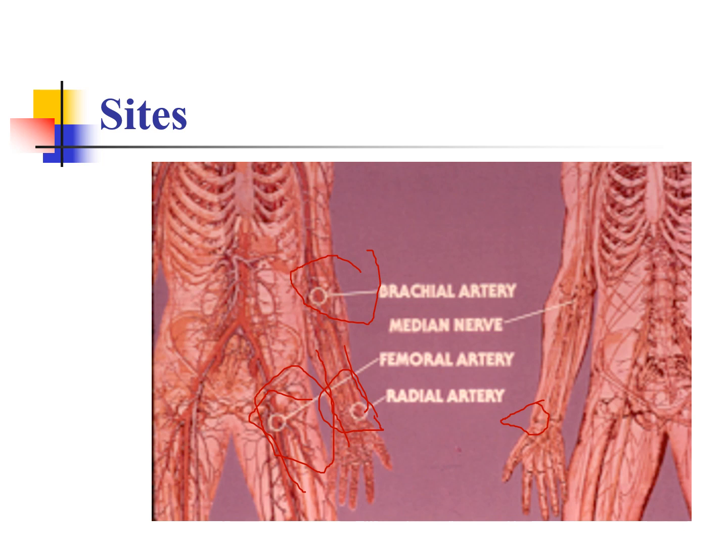Because all this blood shunts away from your brachial and your radial during a code, probably the best site for blood gas during a code blue is going to be this femoral artery area here. So femoral artery during a code, radial and brachial, usually more for standard patients. As far as arterial lines go, radial, brachial and femoral are options.